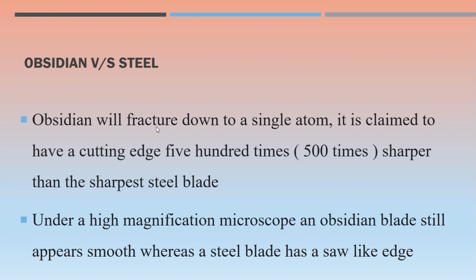Then a very interesting comparison between obsidian versus steel surgical blades. You will be surprised to know that this obsidian can fracture down.